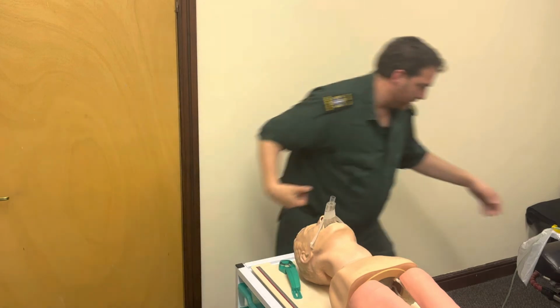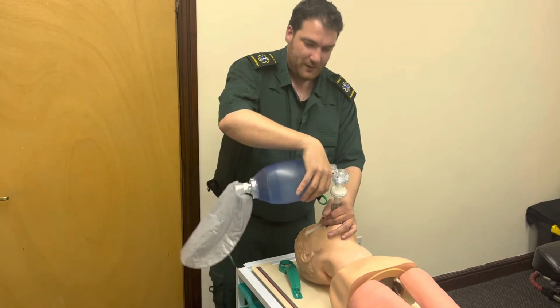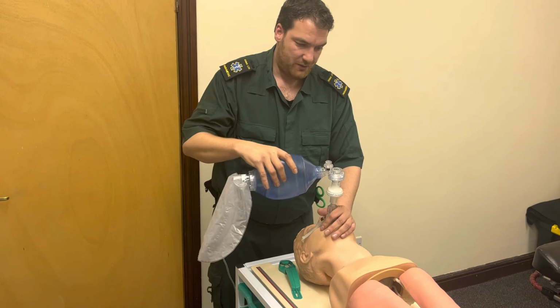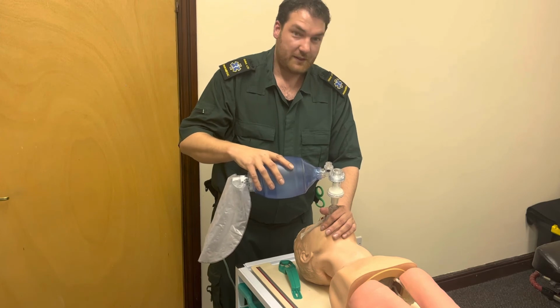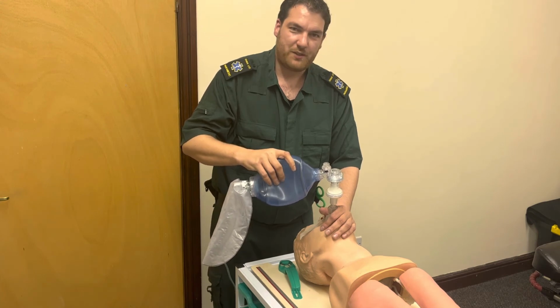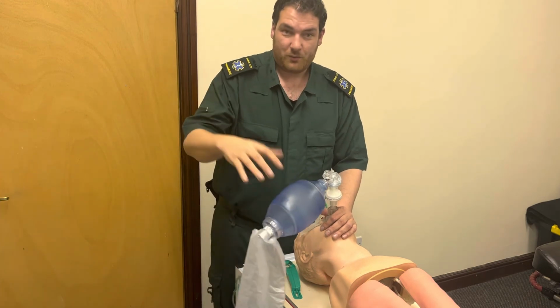Now while they're doing compressions, imagine the tape is sticking. We'll put this in like that, and now, instead of doing 30 to 2, we're now going to do 1 breath ventilation every 6 seconds. So 1, 2, 3, 4, 5, 6. 1, 2, 3, 4, 5, 6. If you notice, I'm doing it every 12 compressions because it should be 2 per second. And that's what you do with that.